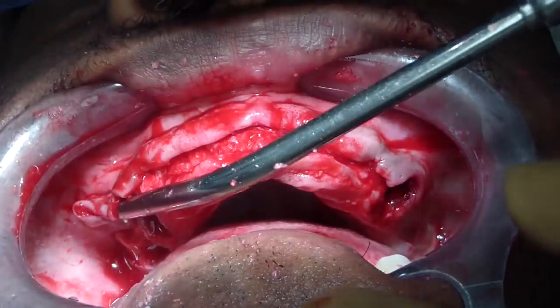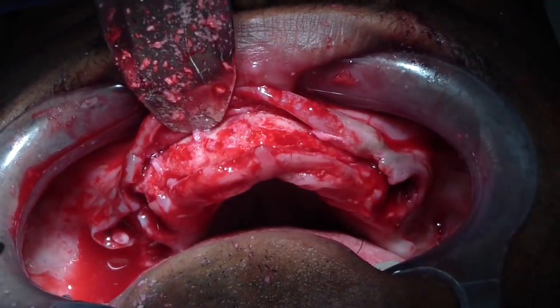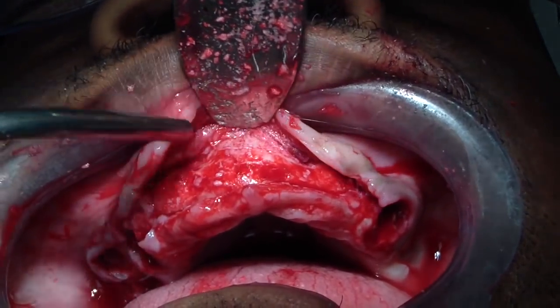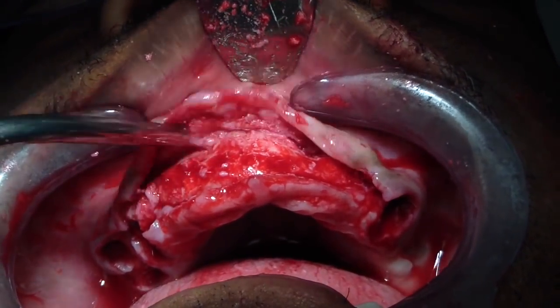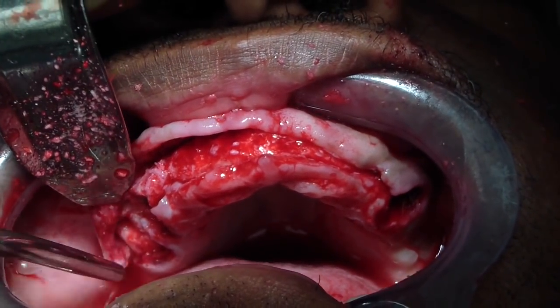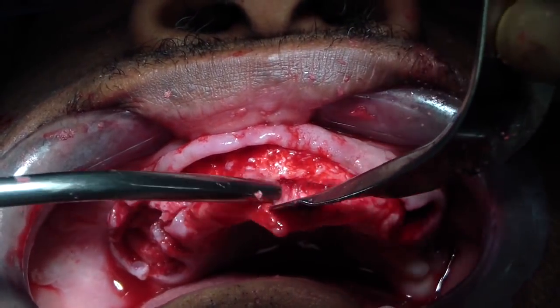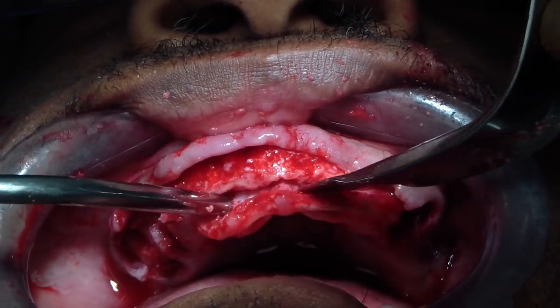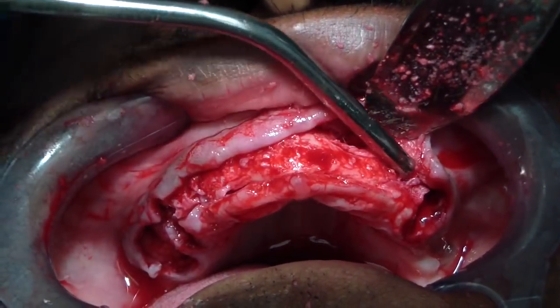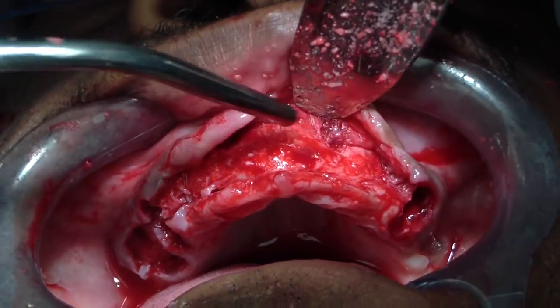Now we are going to suture. This is just a review about cleaning, cleansing, and irrigating underneath the flap. We are using regular irrigation — we will do it three times. It's a tip I learned from my oral surgery mentor for all types of surgical procedures, especially those involving creation of osseous debris. We are using Copeland suction while my dental assistant is refilling with 30-milliliter syringes, and I am getting underneath the flap to remove any debris.